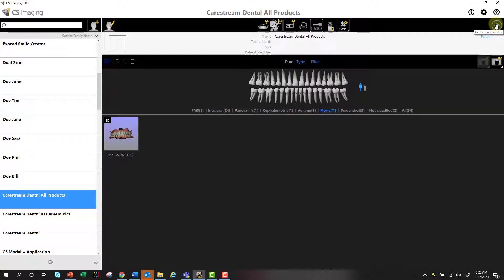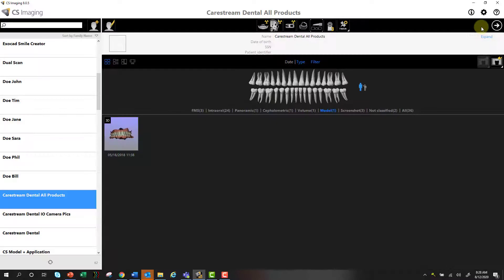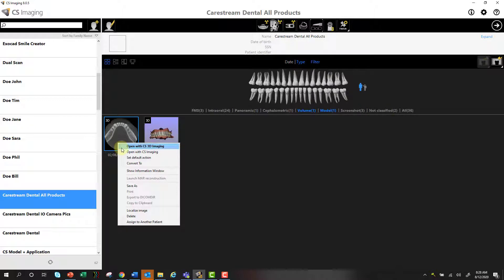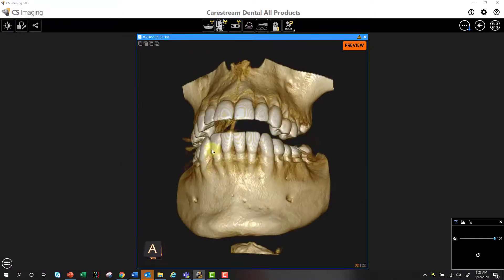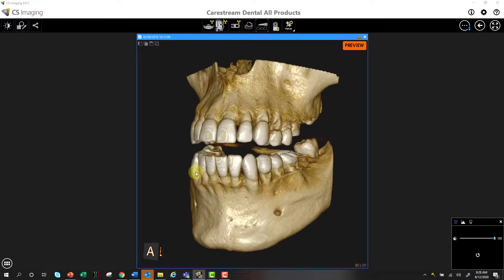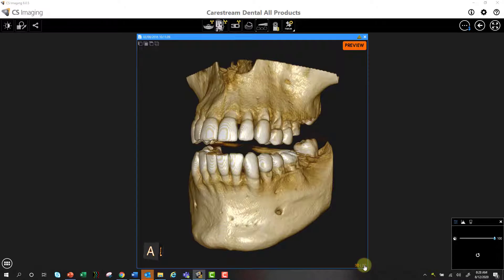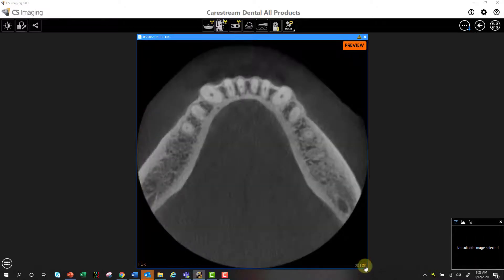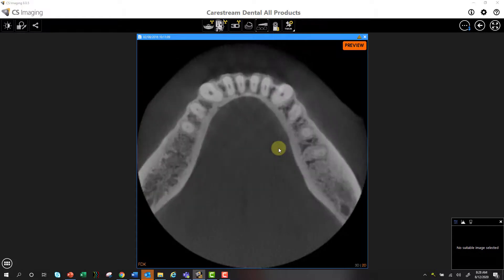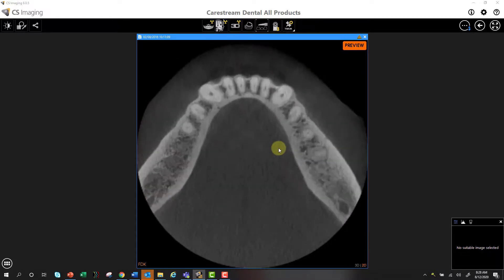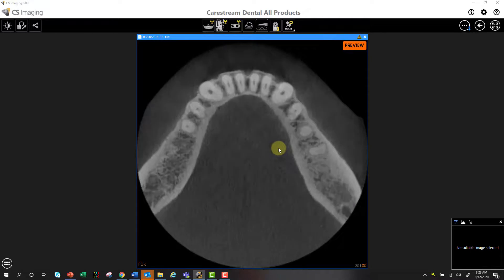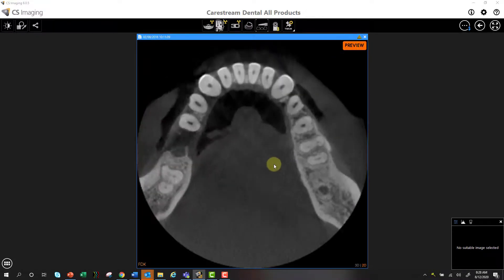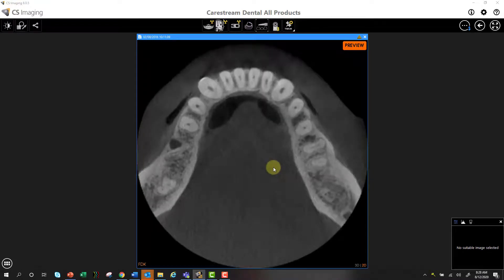This is where I can launch into my viewer, and this is back to the browser. I can do the same thing with volumes. So I can actually right-click and say open with CS Imaging. It takes a second for it to render, and you can see here I can see my 3D rendering. Or I can switch to this icon over here down below, and it's going to give me my axial slice, which I can use my mouse wheel for a quick view of that volume. And only an axial slice. It will always say preview because you're not looking at the entire volume, you're just looking at a preview.